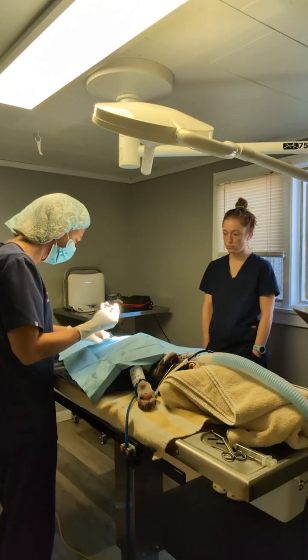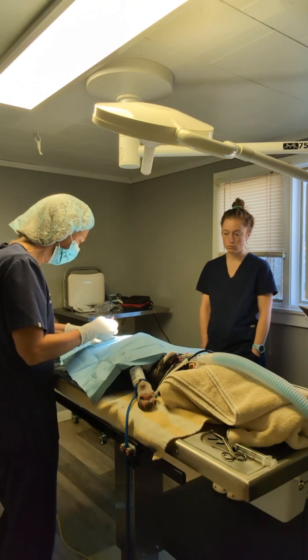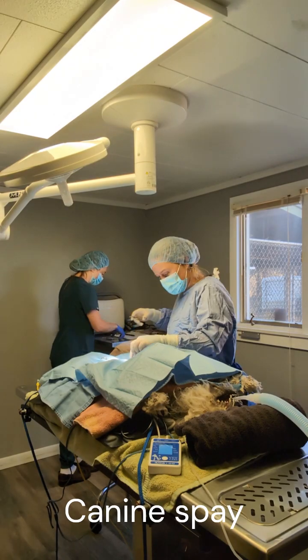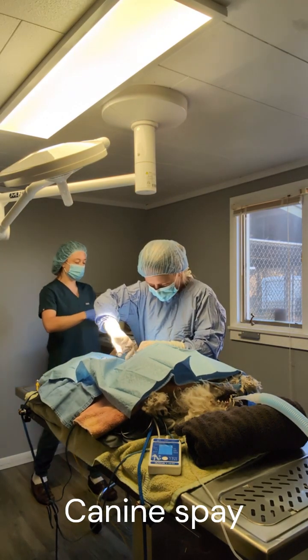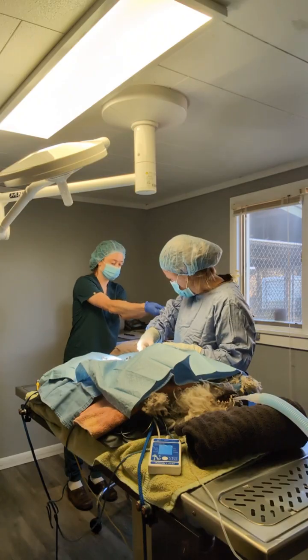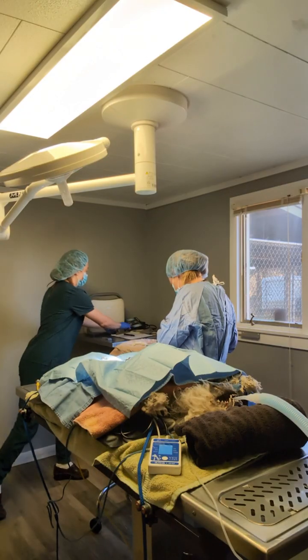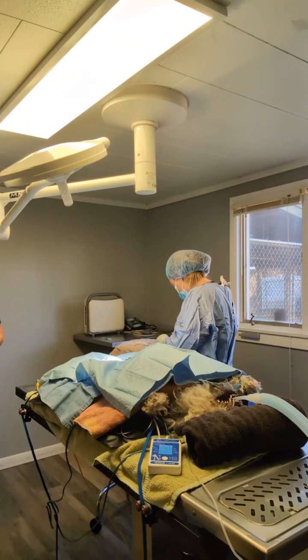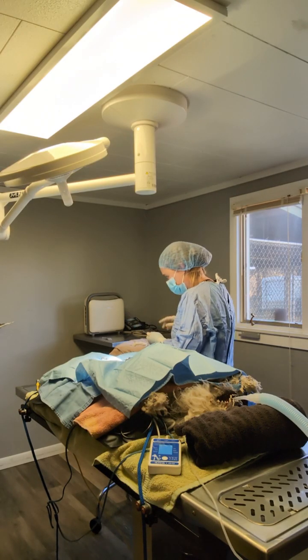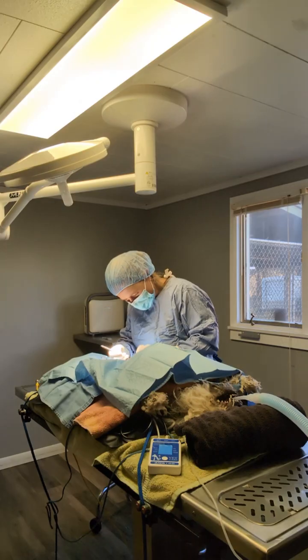Okay, cutting. So, as I bet, this thing just stays in one spot. Do you just want it on the tray, or do you want to take it? The tray's on the tray. It's stuck in there. Yeah, that's not ideal. Happened a lot more recently. Oh, really? He kind of gives it to me half sticking out. Yeah. He just doesn't want to get out of the second seal. Okay, we're gonna go and start cutting.